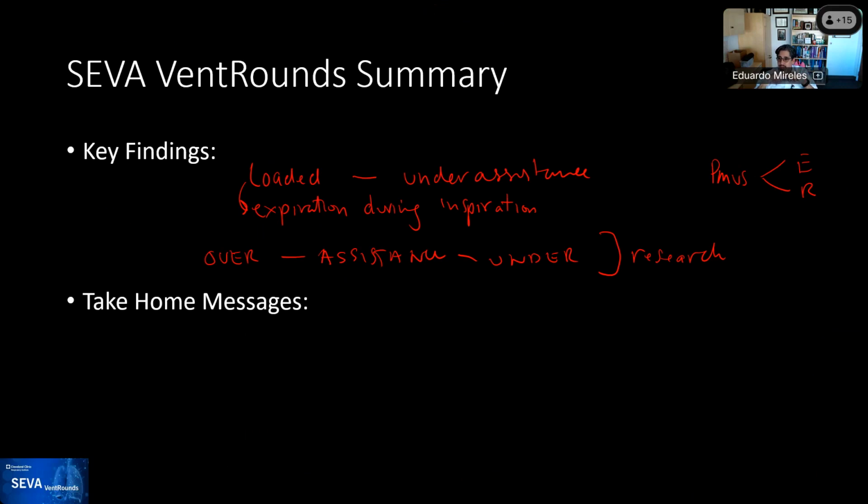Yeah, so Ariel talks about looking at the amount of effort and then changing to another type of mode where it's set point depending on your goal and the main problem. Rob talked about, remember, TI and TE, so the inspiratory time and the expiratory time, defined by flow waveform, not by pressure waveform. Excellent, excellent points. So TI and TE are defined in the flow waveform. Flow defines the breath. Yeah, thank you, Ariel, for clarifying that. Inspiration and expiratory times. Very good.